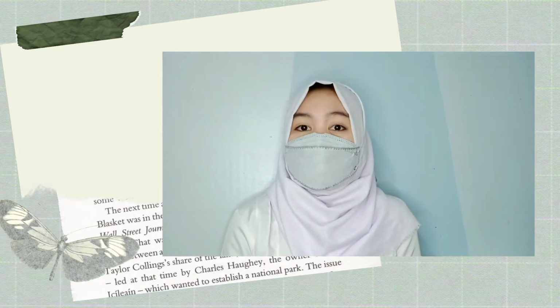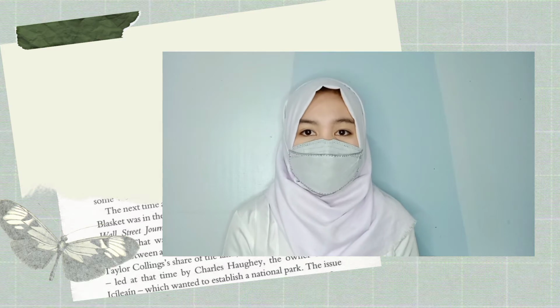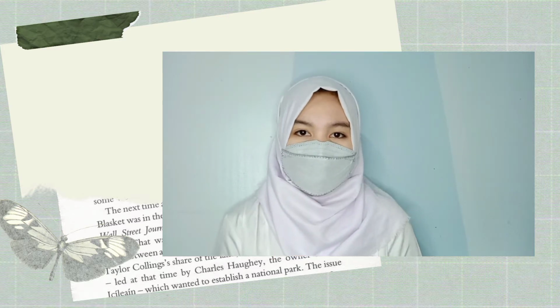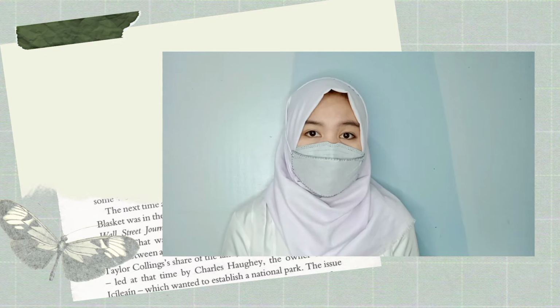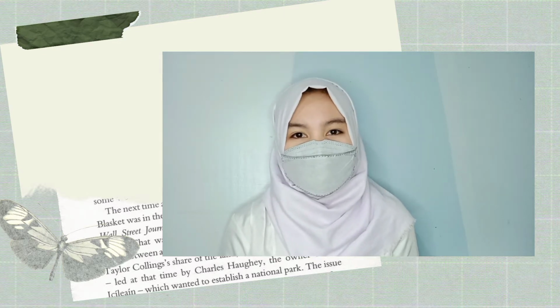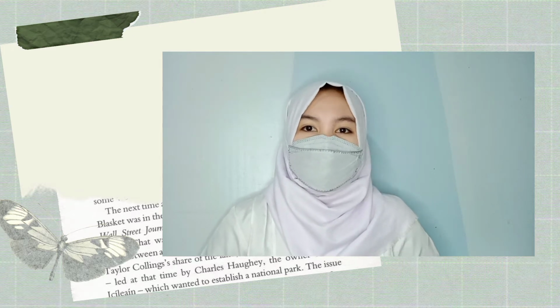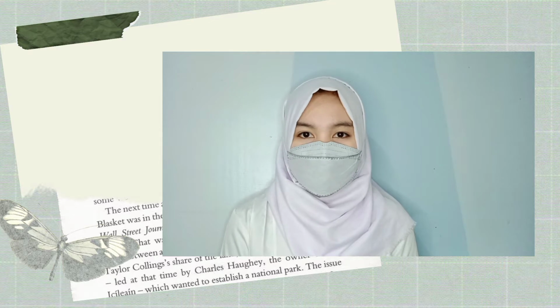Measuring fundal height is measuring the distance from the pubic bone to the top of the uterus, in centimeters, after 20 weeks of pregnancy. The fundal height measurement often matches the number of weeks of pregnancy. Its purpose is to assess fetal growth and development during the pregnancy. You'll only use a tape measure in this procedure.